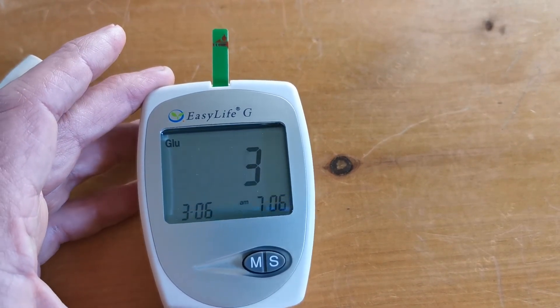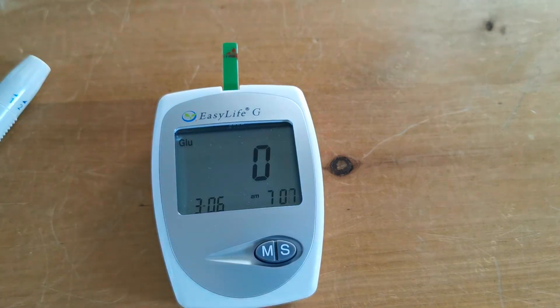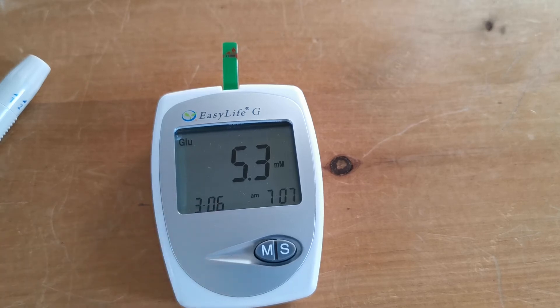The countdown time will vary depending on the type of test strip you're using in the meter. Once it's calibrated and everything is correct, it will show you the result when it has processed the sample.